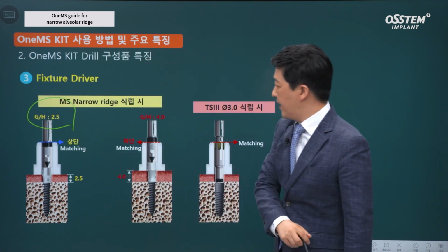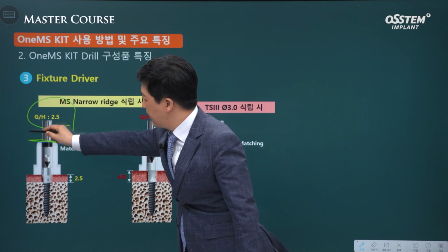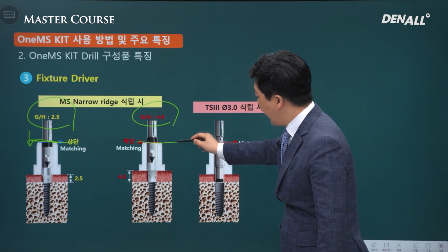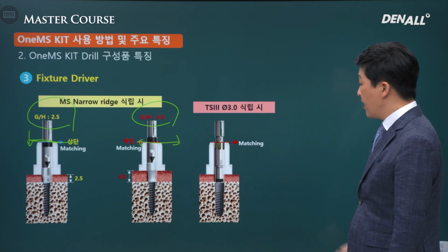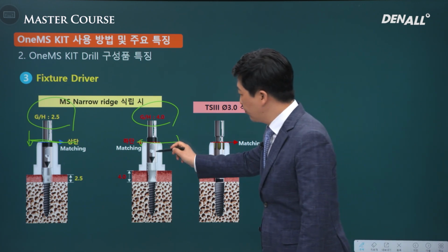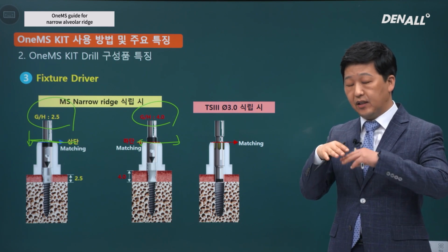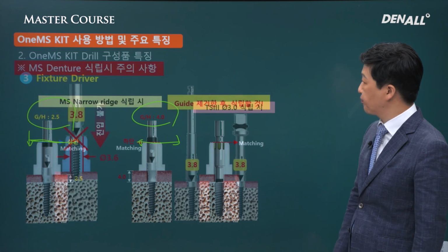In other words, if gingival height is 2.5, when we place that implant, this should be fully within the guide, and when placing implant with gingival height of 4.0, place the implant just below the black line. What we need to be careful of is that when we do immediate implant placement, at times it is difficult to abide by this black line, so you need to remove the guide and adjust the implant's final depths.